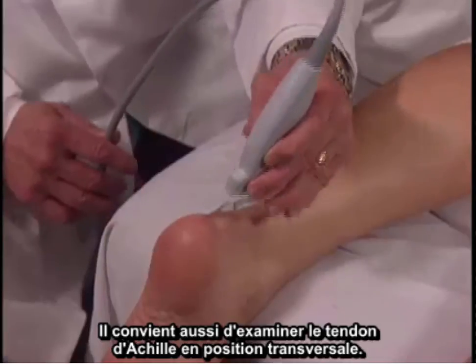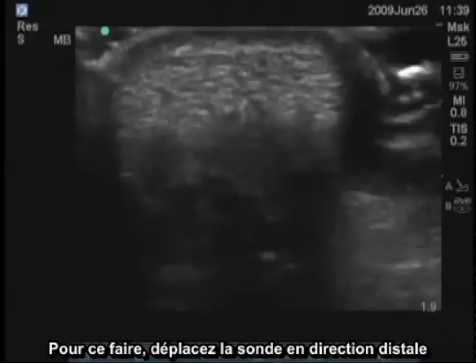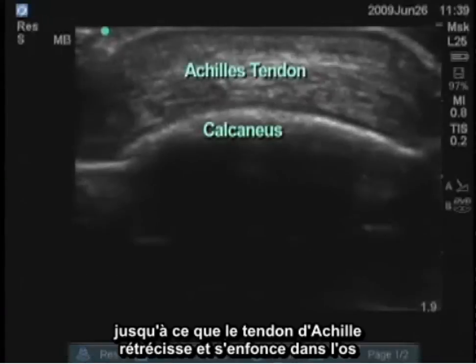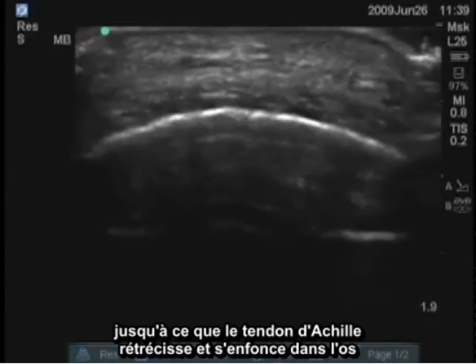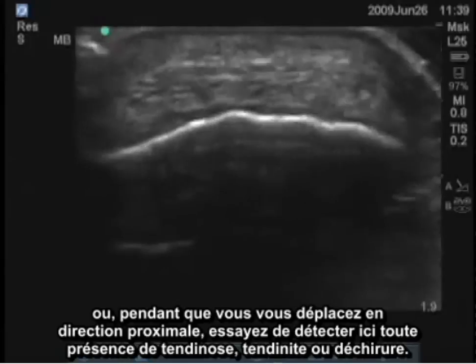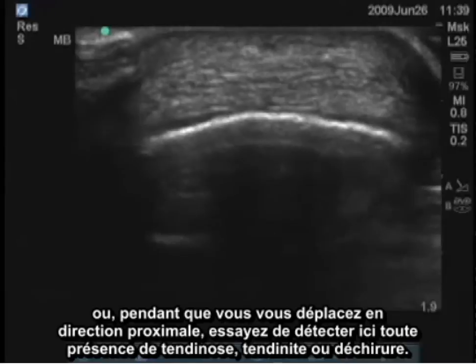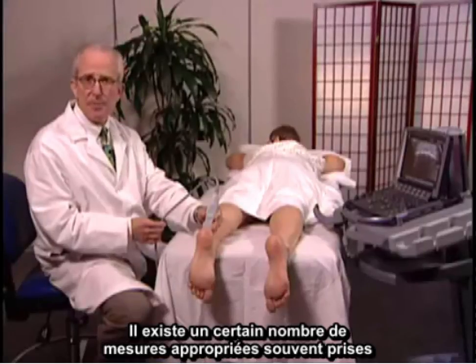We should also examine the Achilles tendon transversely. This can be done all the way distally to the point where the Achilles tendon gets smaller and inserts on the bone, or as we move proximally you might be able to see areas of tendinosis, tendinitis, or rupture.